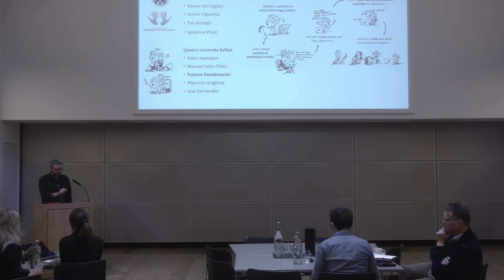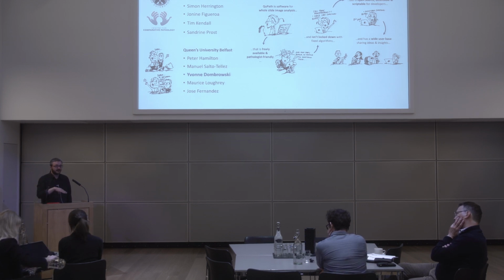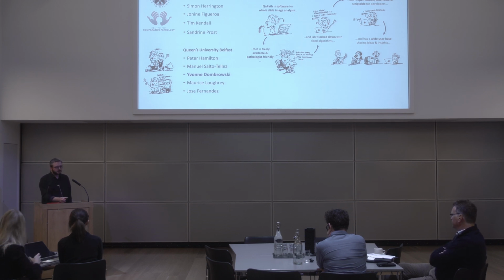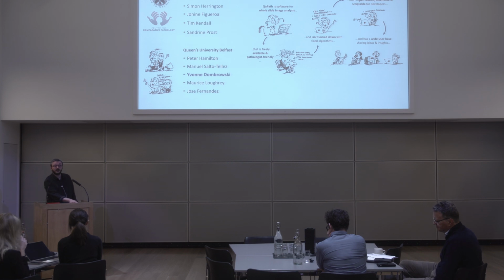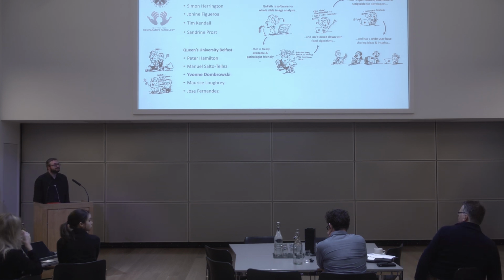I think that what something like this and what these kind of open source tools can do is that they can make it possible to do lots of interesting research studies, come up with novel algorithms in a tiny fraction of the time they would otherwise take. But they aren't themselves perceived as being research necessarily. And I think that is the problem. So these tools that you're describing, I assume they probably could make the leap, but do they have the funding and the support for somebody to help them make the leap? And that is an issue. I agree.